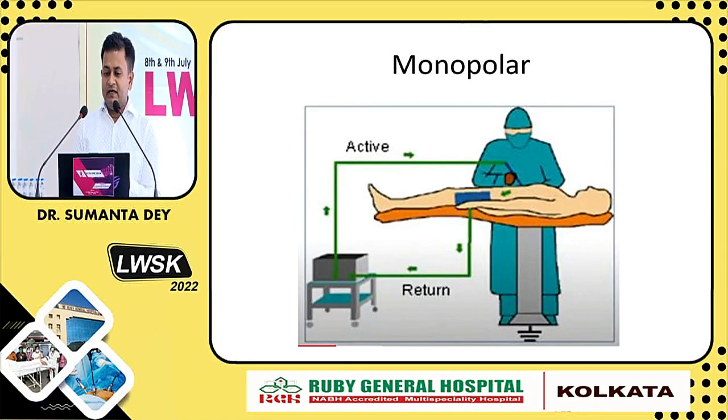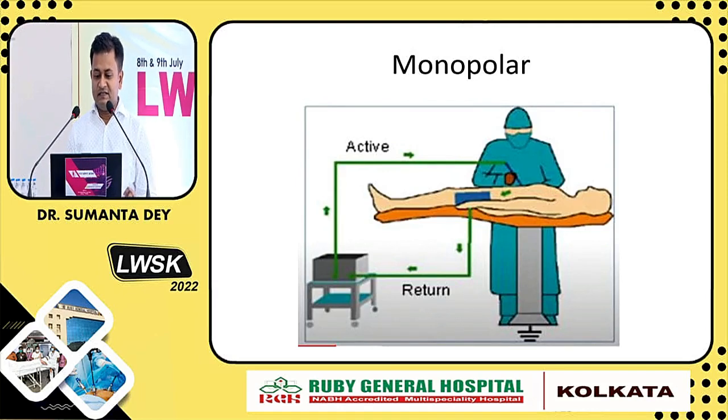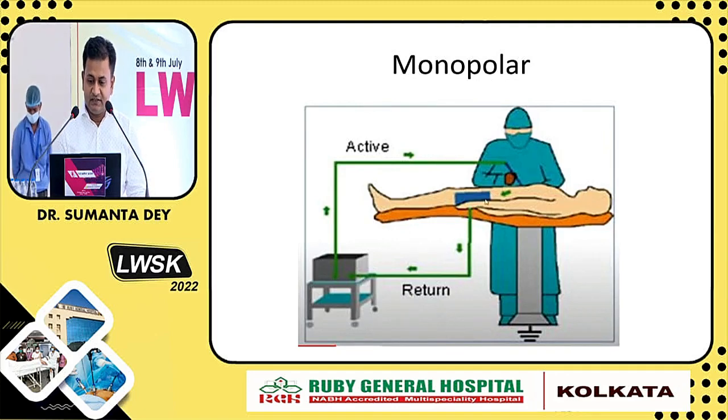I think most of you know the actual concept of monopolar energy, where this is the electrosurgical generator. Once you press the pedal with your foot or in your hand, there is a handpiece. If you press the pedal, the electrons come through the electrosurgical generator. This is the active electrode, and through the tip of your handpiece, the electrical energy will be delivered into the patient's body, and it will be converted into heat energy and produce the desired effect. The electrons will travel through the patient's body, through the path of least resistance, and this is the return electrode pad that we usually put on the thigh of the patient. Through that return electrode pad, the current energy will dissipate and go back to the generator, and this will complete the circuit. This is the concept of monopolar energy.